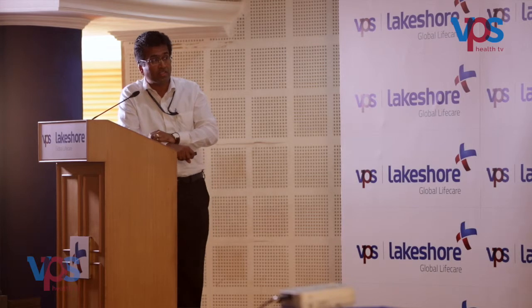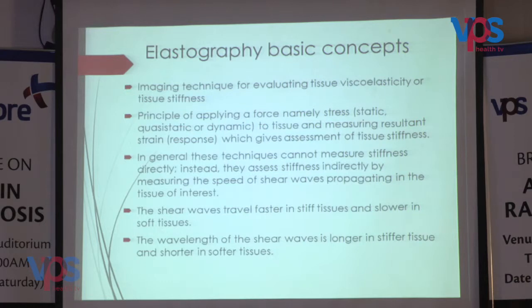So, basic concepts. I will just touch on a few points so that you will get an idea of what MR elastography is all about. It is a technique to evaluate tissue viscoelasticity or tissue stiffness, just like on palpation you evaluate the stiffness of a tissue. It implies applying a force, either static or dynamic, to tissue and measuring the resultant strain or response, which gives an assessment of tissue stiffness. In general, this technique cannot measure stiffness directly. It's an indirect measurement based on the wavelength, on the assumption that shear waves travel faster in stiffer tissues.